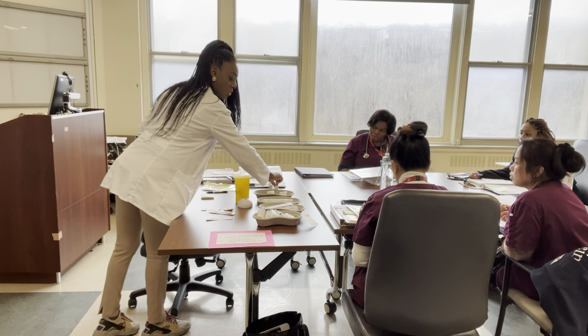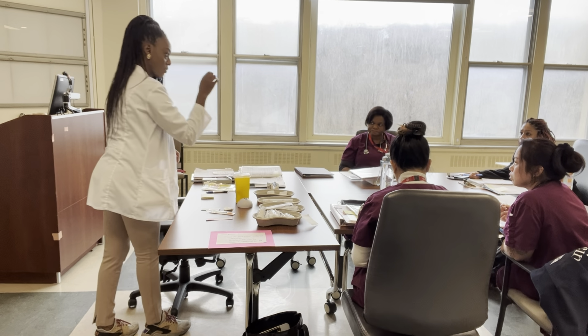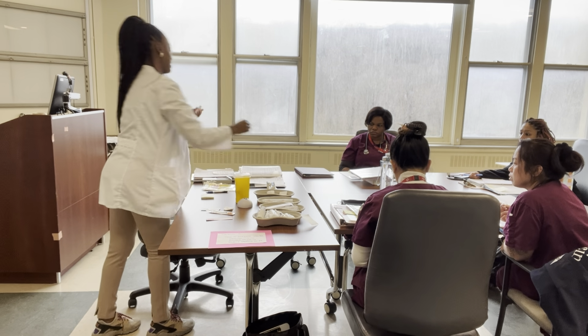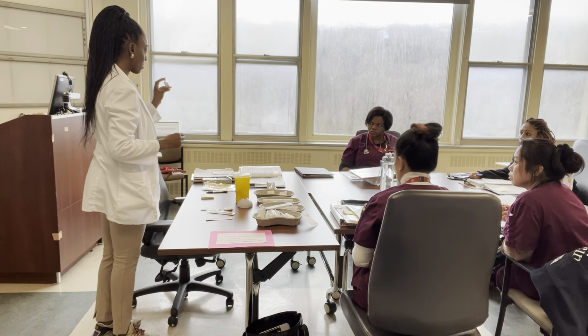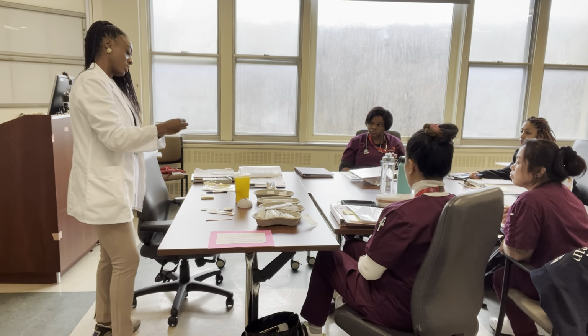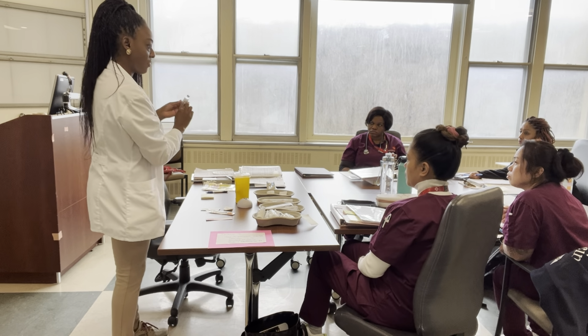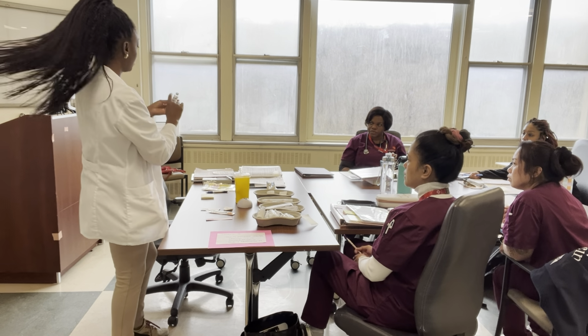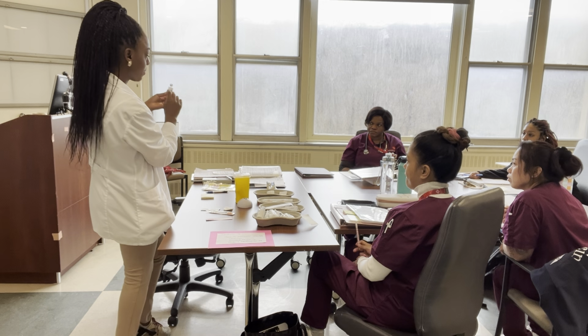Gauze, and then we need the type of insulin that we're going to be administering. Here I put Humalog. Obviously, it's not really Humalog, it's just sterile water, but I want you to pretend it's Humalog, right? So when we look at this vial, we're going to look at what on the vial? The name of the medication. Good. So we're going to pretend it says Humalog. Right now it says sterile water.